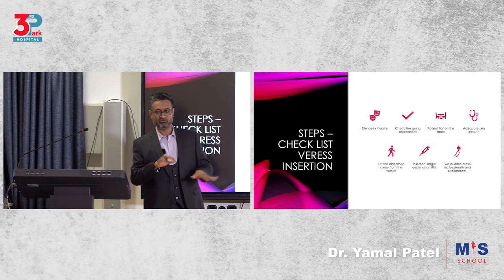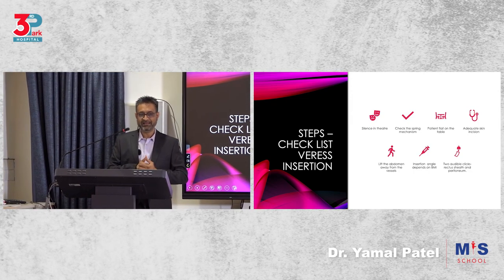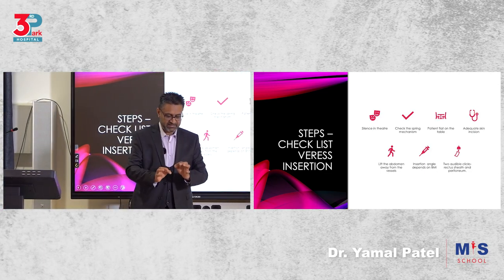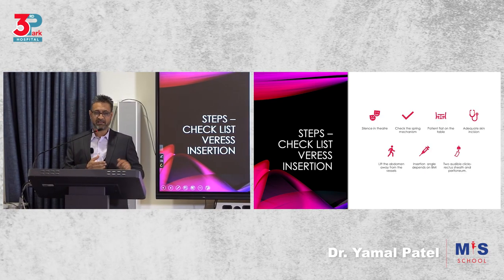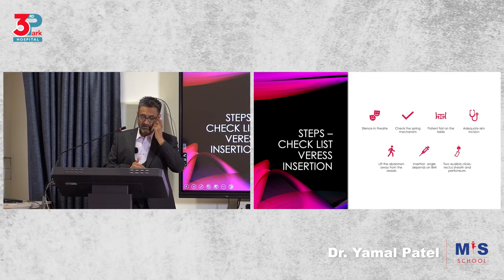So these are some of the basic steps, just to lay down the basics. In Veress entry, number one, try to maintain silence, because people doing Veress entry are going to feel for clicks and listen for clicks. So don't have a very noisy theater. Check the spring mechanism, that's for the nurses. Check the spring before you hand it over.